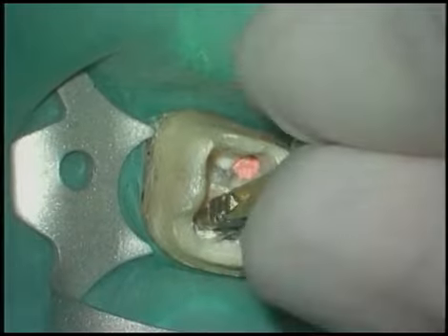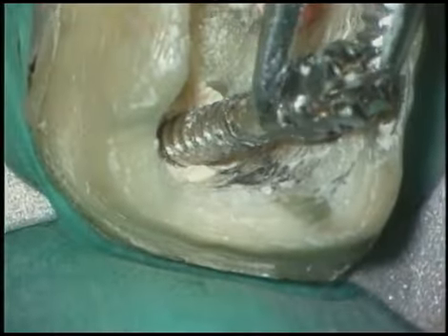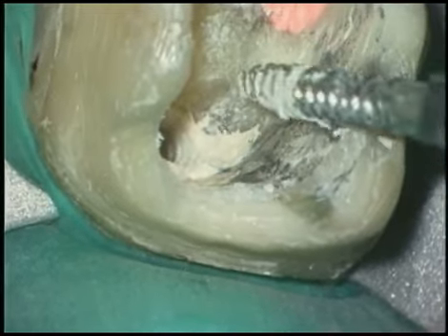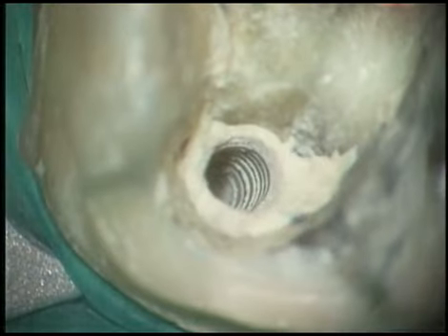In this case, little short counterclockwise strokes begin to back the post up, and the post is liberated from the root canal. You can look down in the canal at high power, and you can see that about 15x, you can see the thread lines or thread marks in the cement wall.